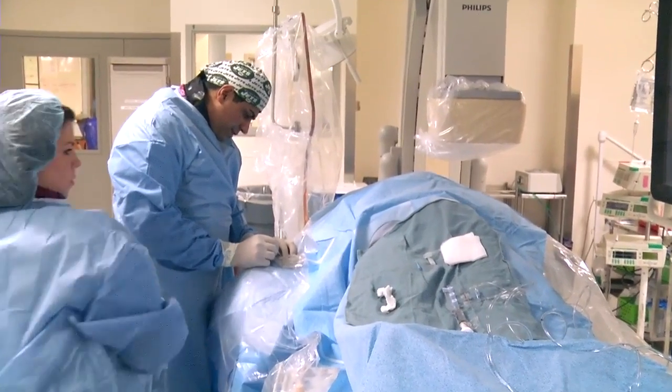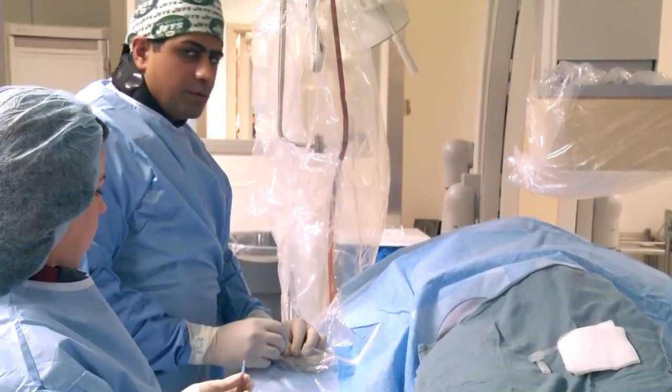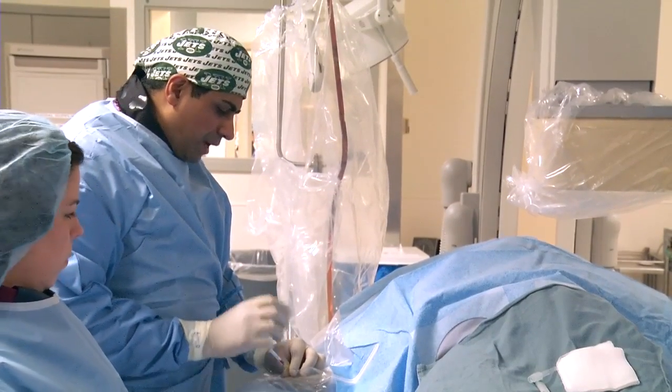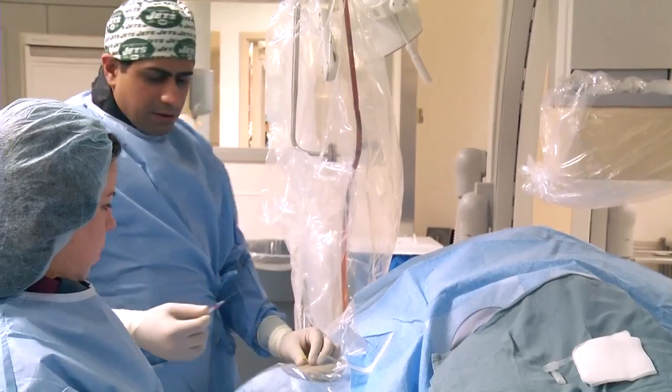So we have a nice flash over here. And now we're going to do a double wall puncture. So I went through the artery. Once I saw that flash, I advanced the needle through the back wall of the artery. And now we're going to take the needle out.